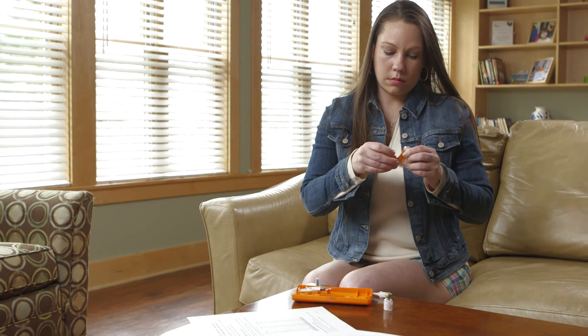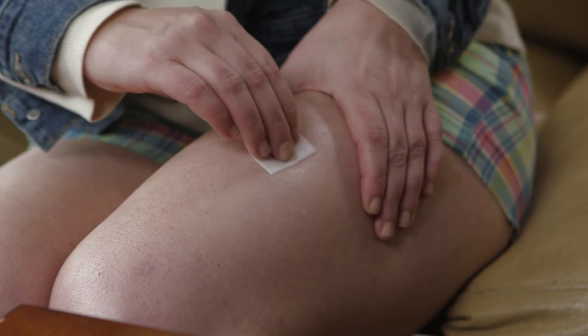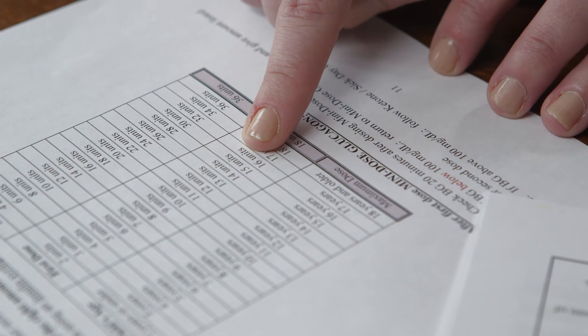Now, clean the site with an alcohol pad and let dry. Refer to the mini-dose glucagon chart to determine the dose.